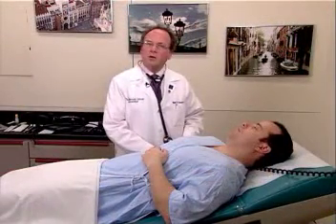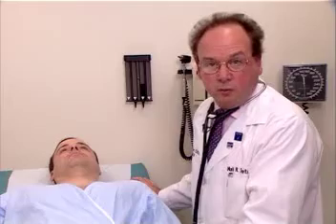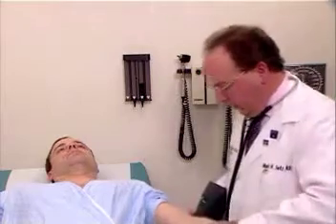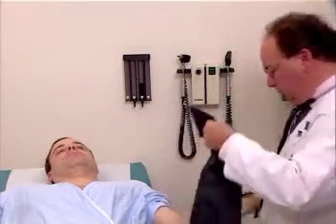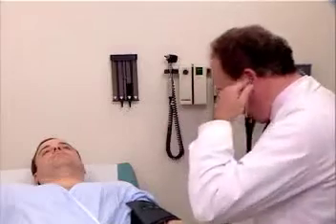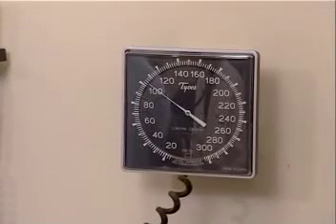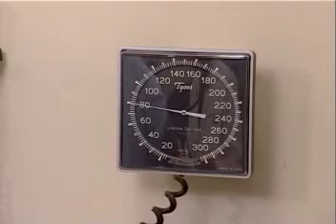After blood pressure determination in the right arm, we're now going to do blood pressure by auscultation in the left arm. We're now going to proceed with blood pressure in the left upper extremity. We only have to do blood pressure by auscultation since we already know what the peak systolic pressure is. Remember that the brachial artery is medial in the antecubital fossa, and the blood pressure cuff is applied just as we did for the right arm. We will pump up the blood pressure cuff to about 20 millimeters higher than systolic, and deflate the cuff slowly to record systolic blood pressure and diastolic blood pressure.